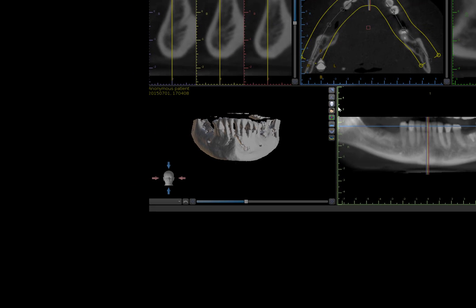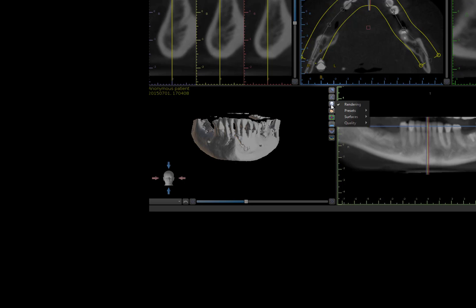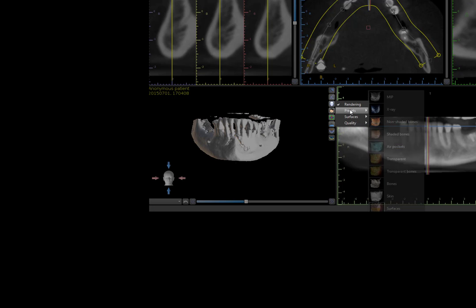The 3D Vertical toolbar can also be used to enhance the 3D images. Left-click on the Rendering icon, then move the cursor to Presets. From the list, click on the Preset mode to select the desired rendition.